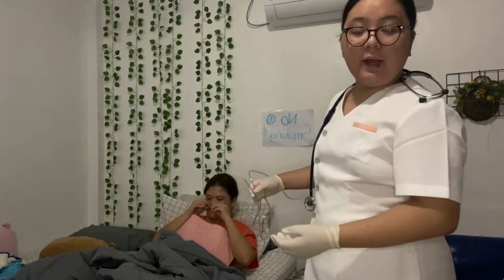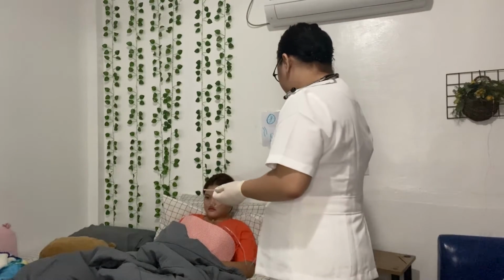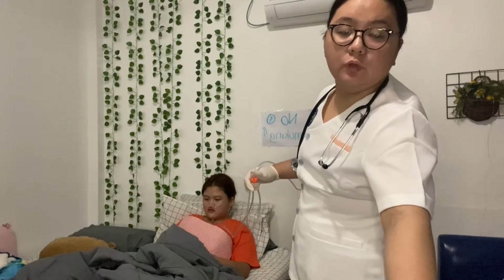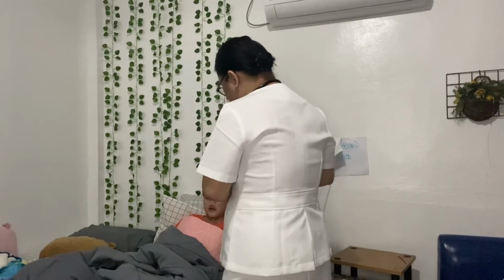And then rinse the catheter and connecting tubing with the NSS until clear with continuous suction. Place the oxygen delivery device, encourage the patient to deep breathe. So, ma'am, nakakahinga po ba kayo ng maayos? Yes po.